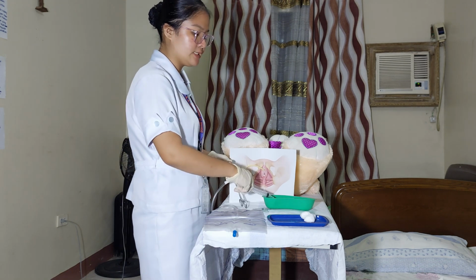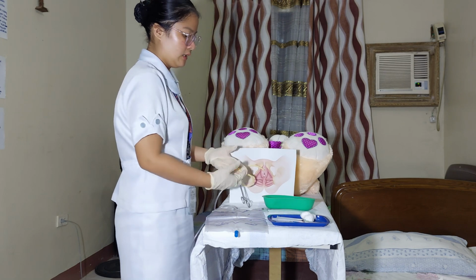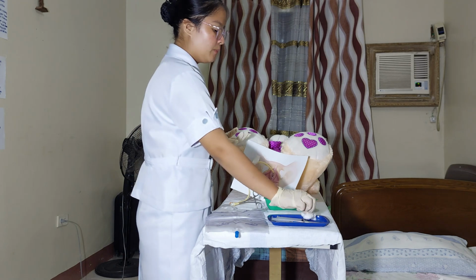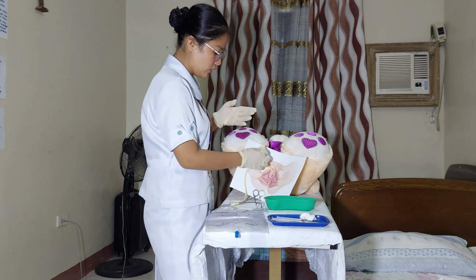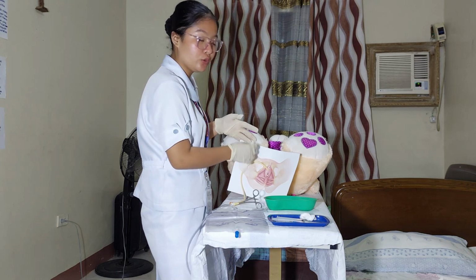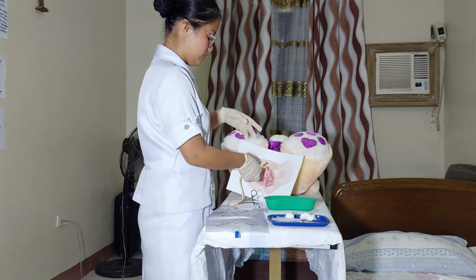So now that the balloon is deflated, I'm going to close my syringe. And now we should get a cotton with alcohol to remove the tape that we used to secure the urine catheter. So that the tape softens, we need to put alcohol on it so that the pulling is smooth.